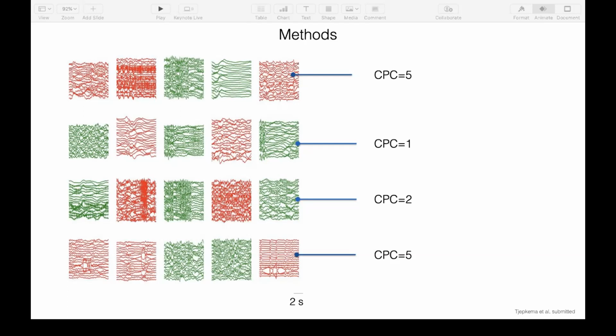And we weren't actually interested in what the human being would call the pattern. We labeled it with a neurological outcome, because all our patients have a follow-up of 6 months. So the red in this example, this epoch was associated with a CPC of 5. So this patient did not do well. And all the green epochs were associated with CPC 1 or 2, and all the red epochs with CPC 3, 4, or 5. And we did that, of course, for different moments in time, because it is extremely time dependent.